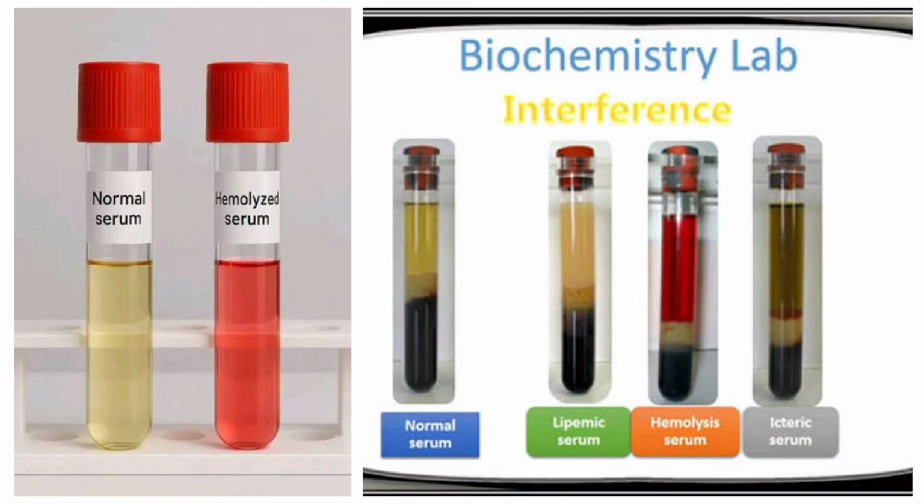Now, if you look at this, I'm not sure if you can see this very well. This is a normal serum and this is a haemolysed serum. I just decided to use these two to give you an explanation of what I'm trying to explain.